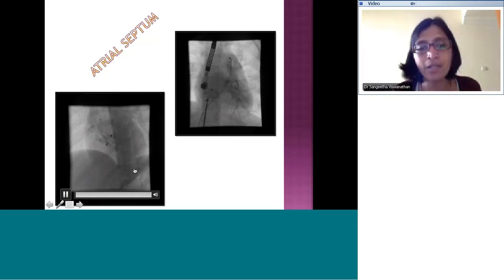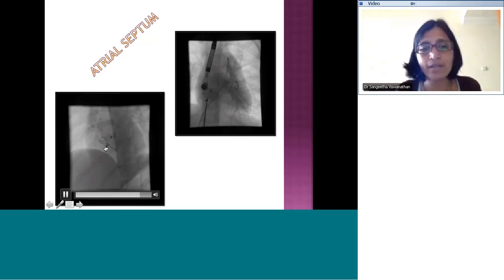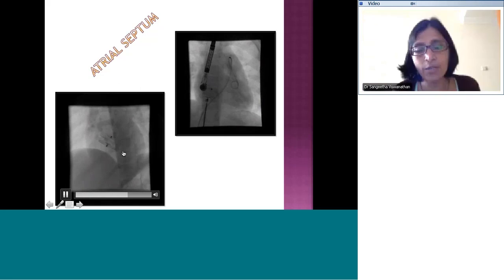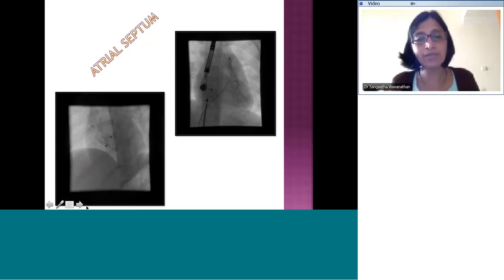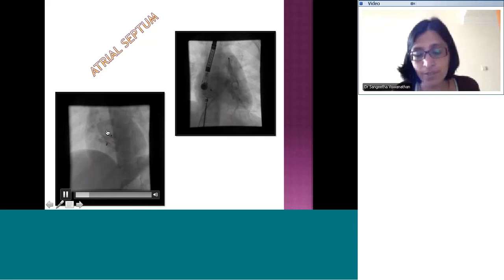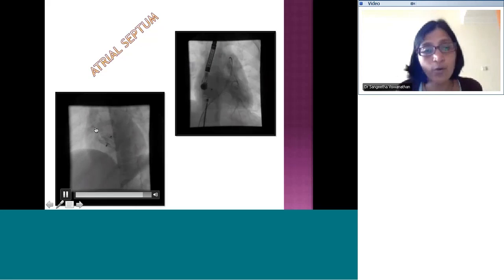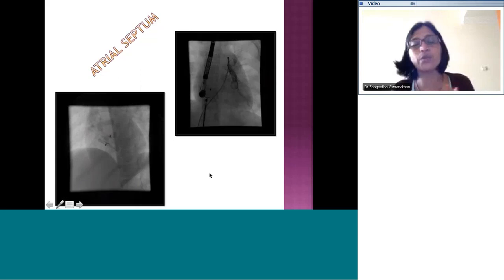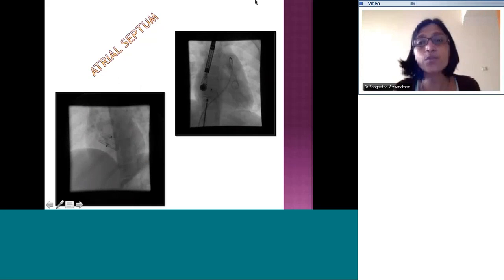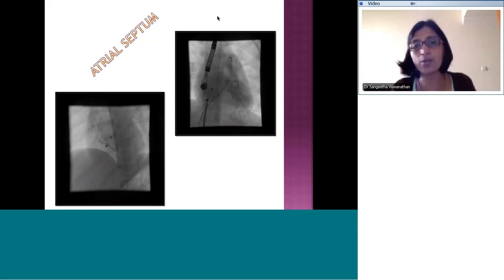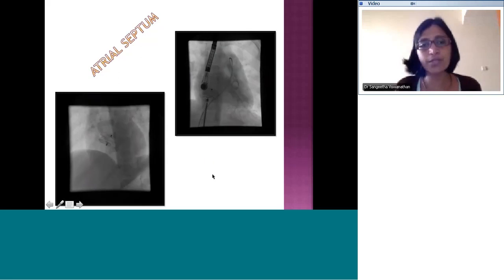For the atrial septum, the LAO view is very useful. A shallow LAO with about 15 degrees cranial shows the device in much better position. You can see the lie of the septum and the separation of the two discs — if the discs are separated it means they are holding tissue between them, confirming perfect positioning of the device. For patients with Fontan who have extracardiac conduits, depending on conduit placement, an RAO view such as 20–30 degrees RAO can be used to look for Fontan fenestration.